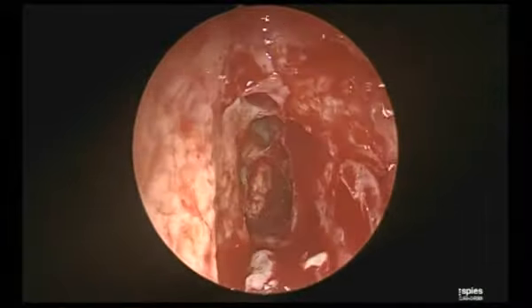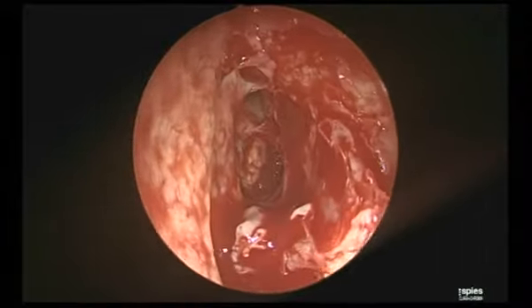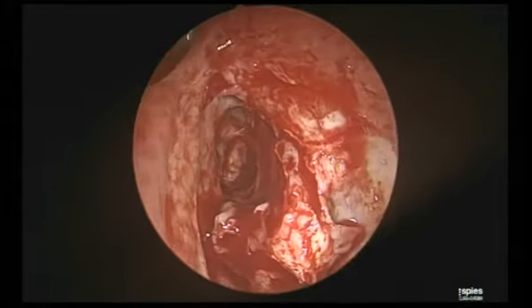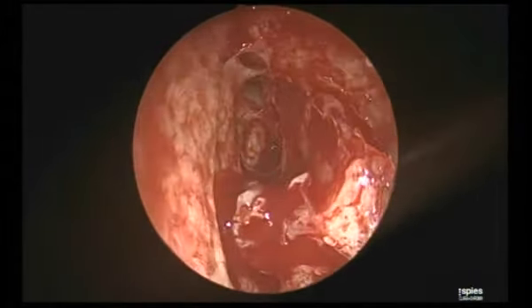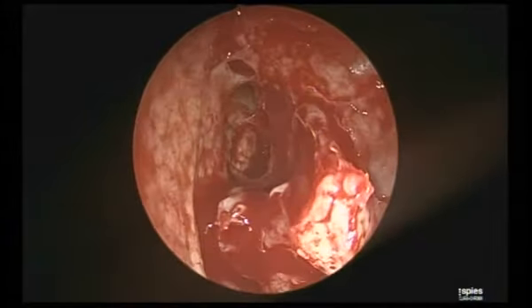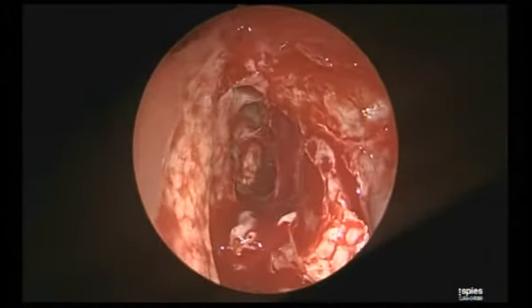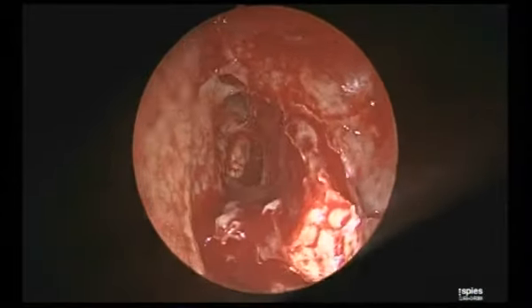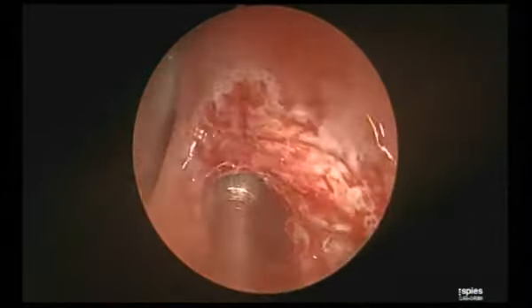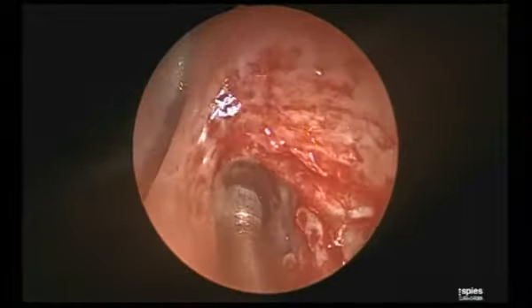Sometimes there are multiple cells, sometimes a big supraorbital cell or an intersinus septal cell, and you can easily get carried away that this could be the frontal. Sometimes it is the frontobullar cell, sometimes the type 3 cell. So how do you identify for sure that, in between these two limits, what you are seeing is the frontal? Getting my point? I'm exactly between these two limits.